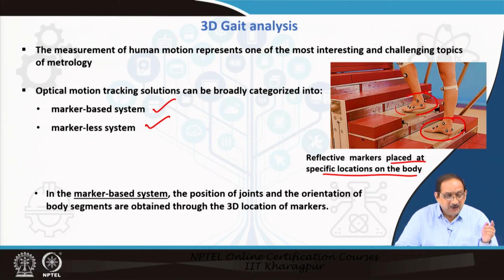Owing to their cost, complexity, and the necessary technical skill of the personnel to run the recording, the markers are placed preferably at specific anatomical landmarks.